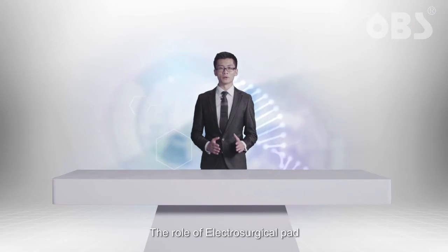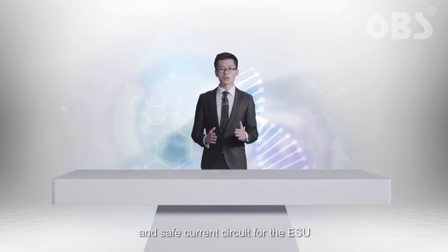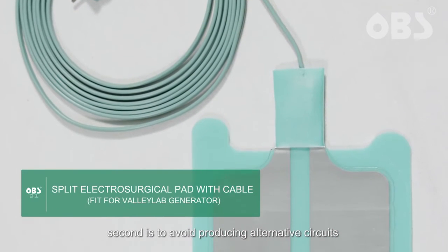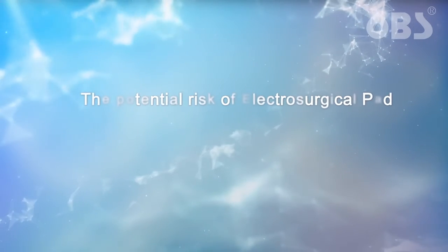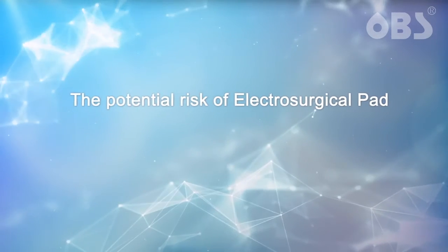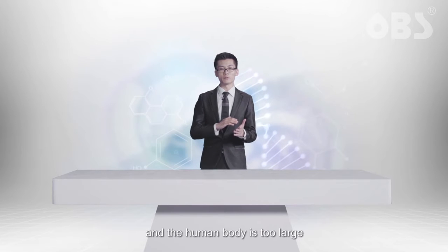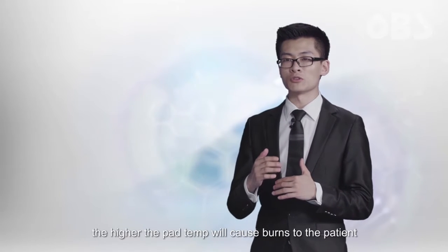The role of the electrosurgical pad. First is to provide a complete and safe current circuit for the ESU. Second is to avoid producing alternative circuits that harm patients or operating physicians. If the current density at the interface between the pad and the human body is too large, the greater the thermal effect of the current, and the higher pad temperature will cause burns to the patient.